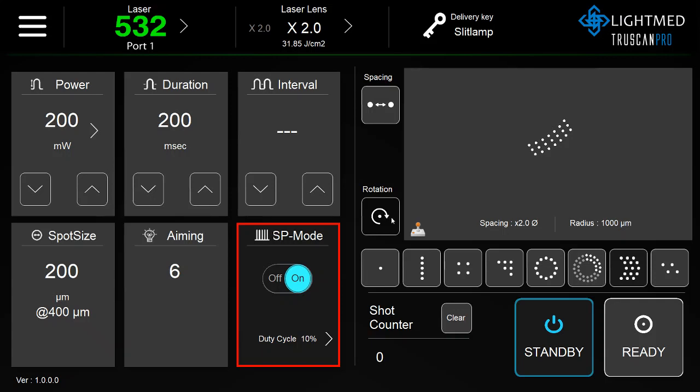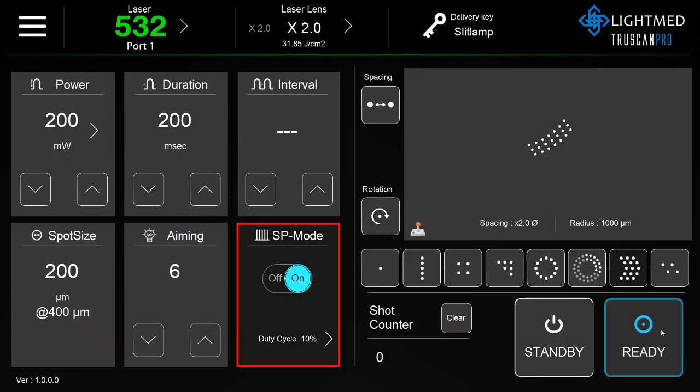When you are ready to treat, click ready. The shot counter will increase as you fire. After every patient when you want to clear the shots, click clear.